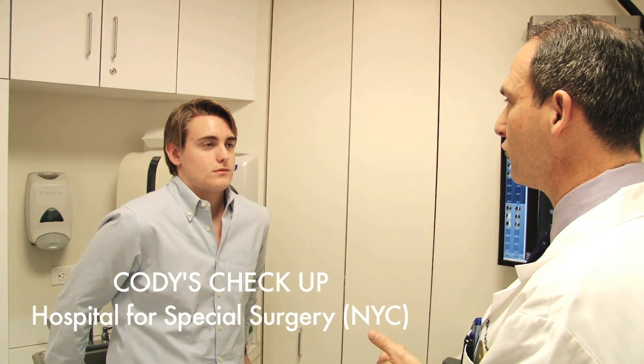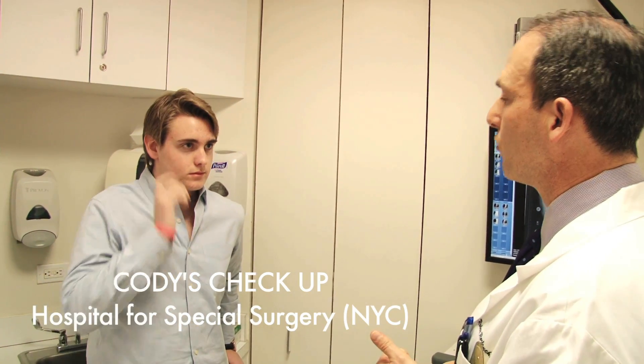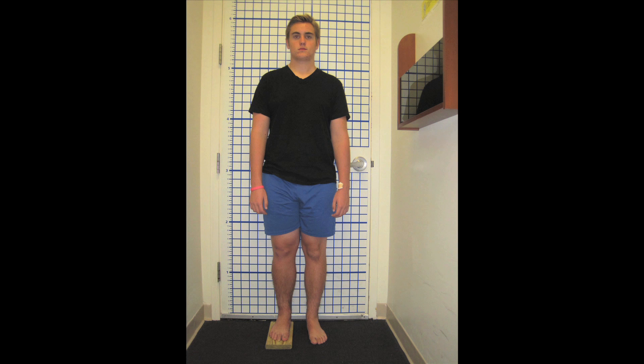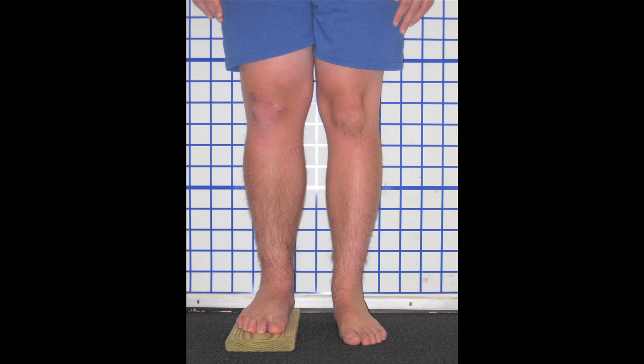So I think we're going to transition you to one crutch or a cane. I think a cane would be nice. You mentioned to me that you like cool canes. I met Cody about a year ago. He came in with his mom. He's 14 years old with a chief complaint of leg length discrepancy and also deformity. His right leg was about an inch and a half shorter than his left leg — it had been like that since birth.